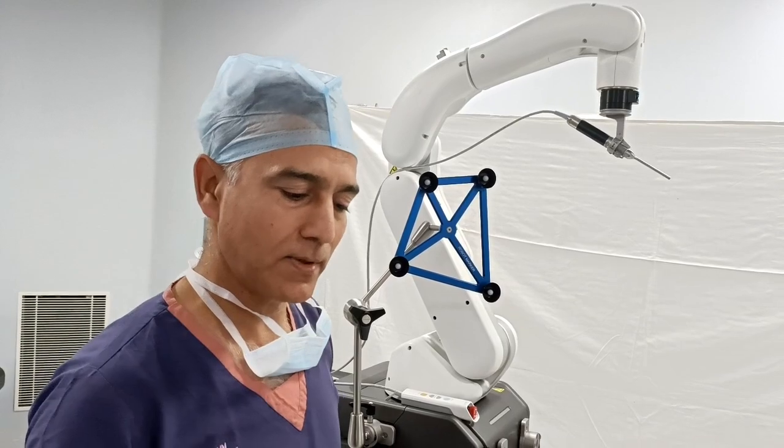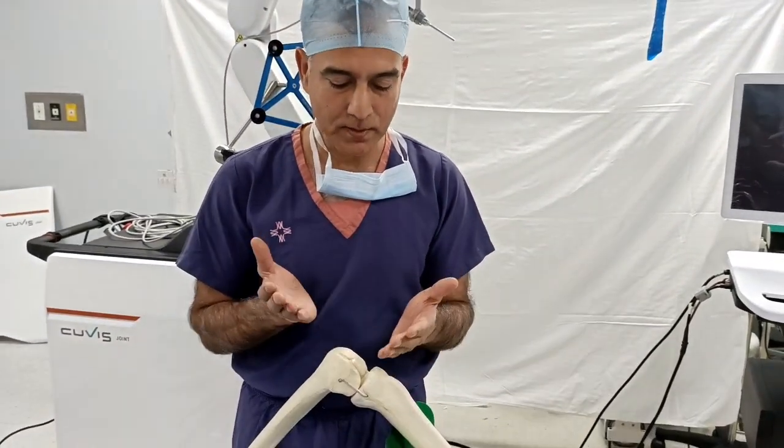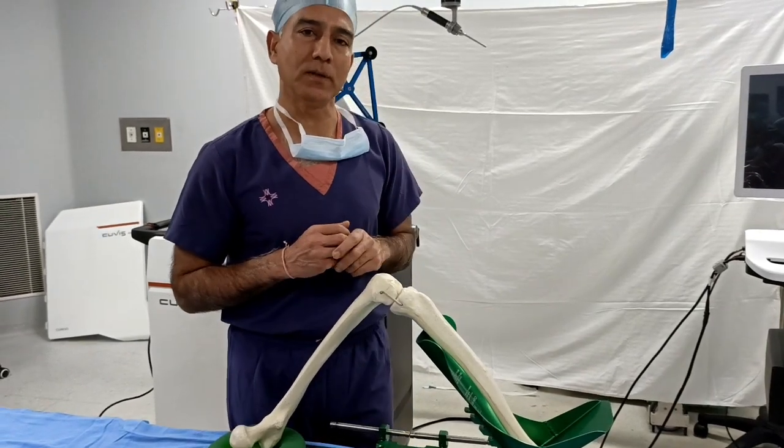For example, we don't just replace the implant — there is a femur and a tibial implant. We will set the position and angle precisely. All of this decides the performance and the longevity of the implant.